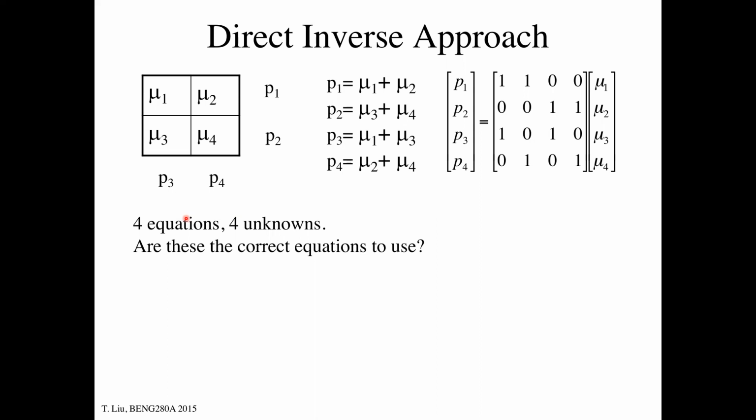Oh, the quality assurance phantom. If you remind me, send me an email. I'll bring a picture of one in next time so we can just look at it. But that phantom is, every day they put this phantom in the scanner and it has water in it. It also has some features that you can measure, spatial edge fidelity and parallel lines, how well they're imaged and stuff like that.